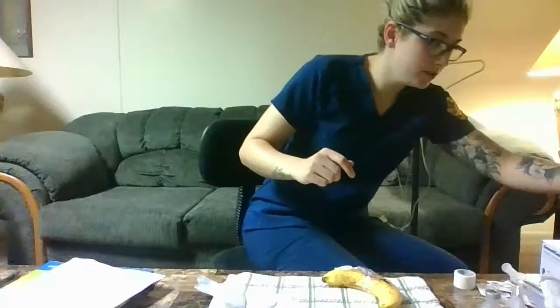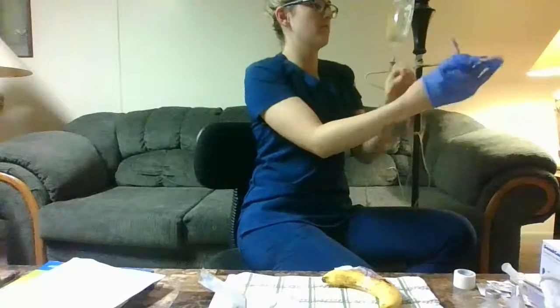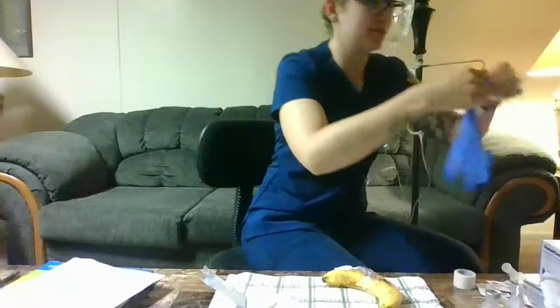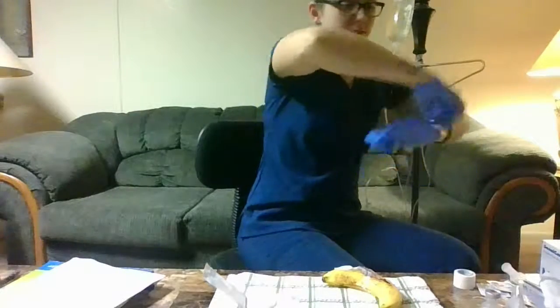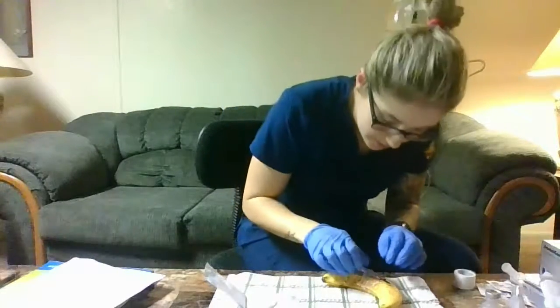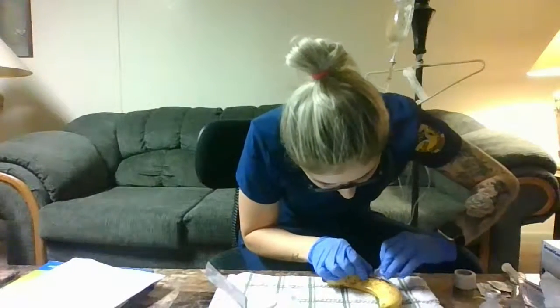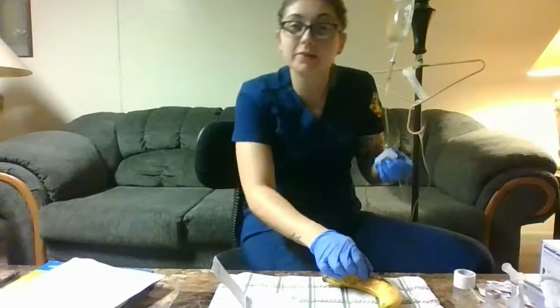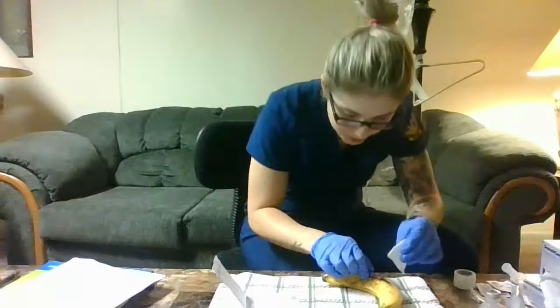Going to put on some clean gloves. We're going to hold the hub and the catheter in while we remove the transparent dressing. Okay. We're going to get the gauze ready because we're going to remove the catheter from the vein and quickly and firmly apply pressure.